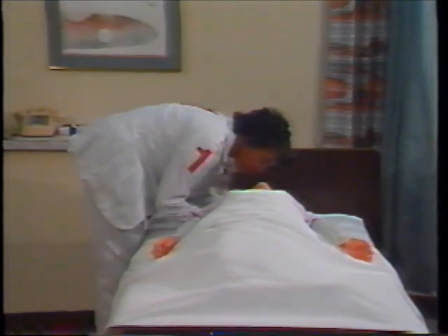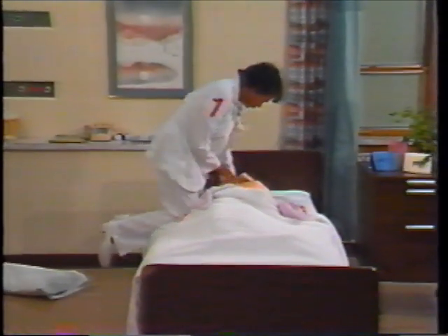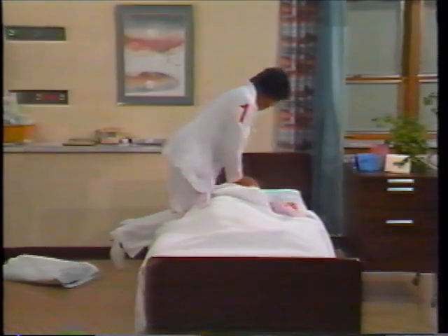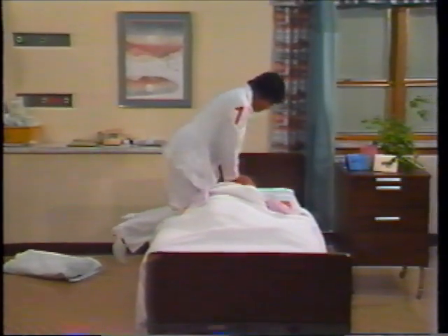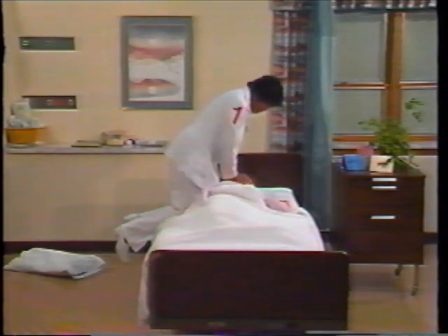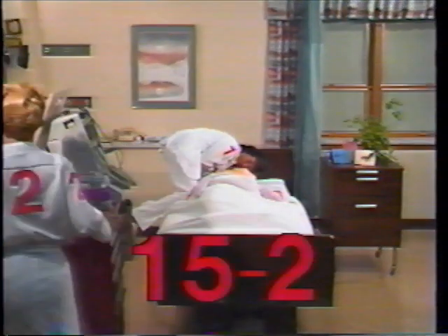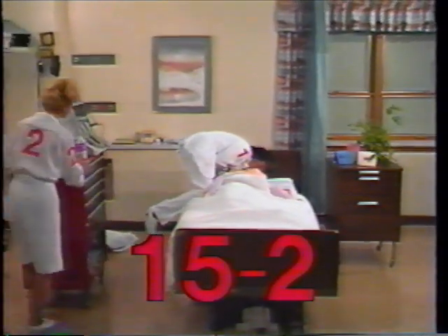She then simulates the activation of the code by dialing the emergency number and telling the operator the location of the arrest. Nurse number 2 enters, verifies that the code was called, and gets the crash cart. During this time, nurse number 1 continues one-person CPR at a 15-to-2 compression to ventilation ratio.